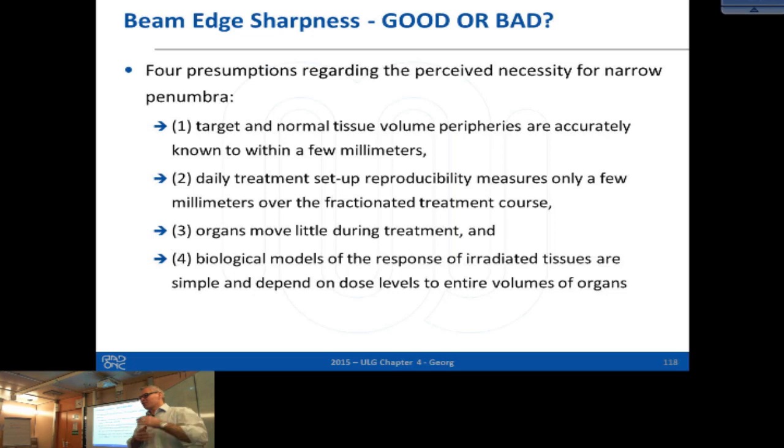And this is something where I think we as medical physicists, having some clue about dosimetry and dose values related to imaging and so on, need to give advice in order to establish these databases for our current and the long-term future. Actually, I guess with the Euratom directive, it should be done by 2018, because they demand to record all those reference values, also for imaging, for all patients for 10 years.